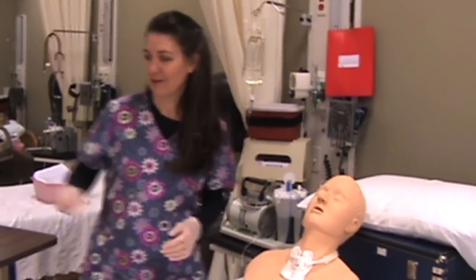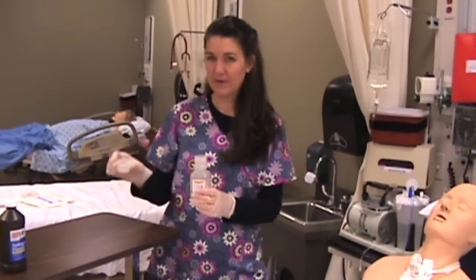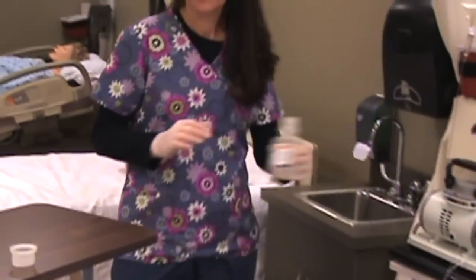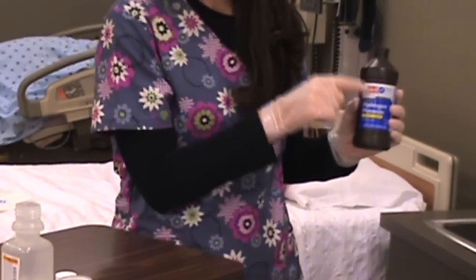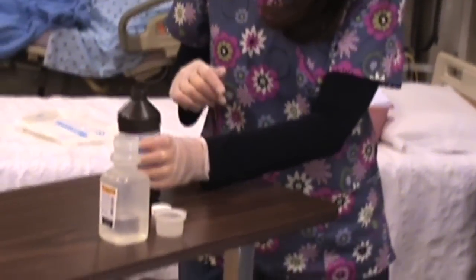Here's my patient. I'm going to take my water — I've already opened it for the trach suction — put the lid up, and pour over the labeled side to cleanse the spout. For the peroxide, I'm going to do the same thing. I'll pour over the red part here so I'll know where I've poured over. So now I have the spouts that are clean.